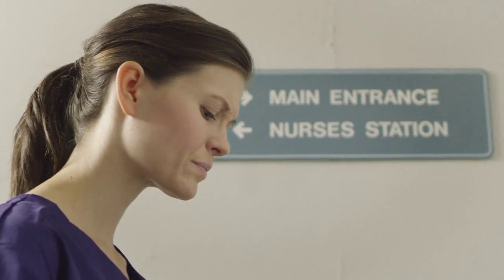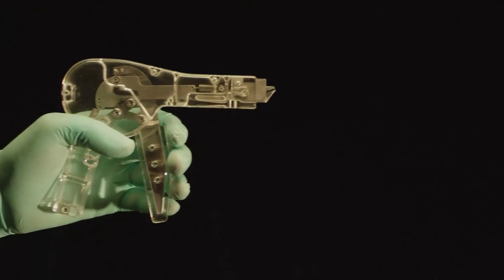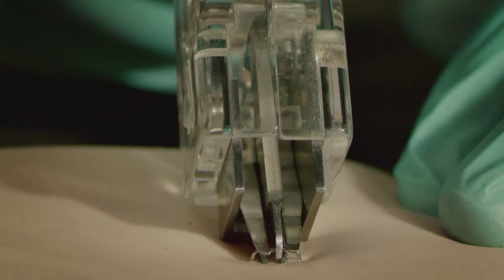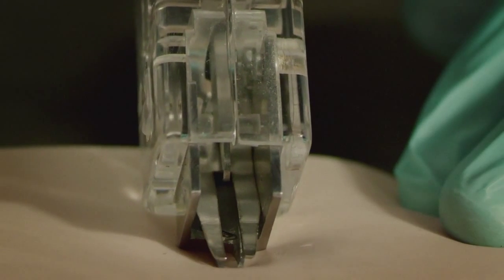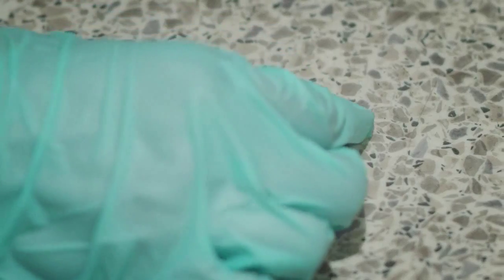Sadly, all this could have been prevented. That's where we come in. The SSR is the first and only device that both deforms and retracts the staple in one motion, securing the sharp in a sterile compartment, making what happened to Linda impossible.